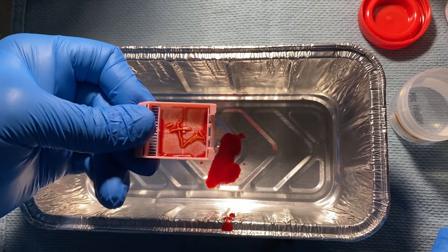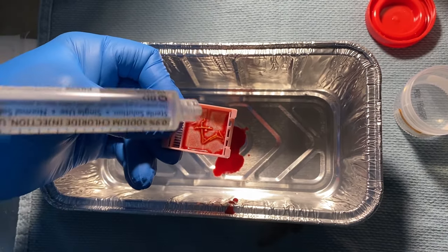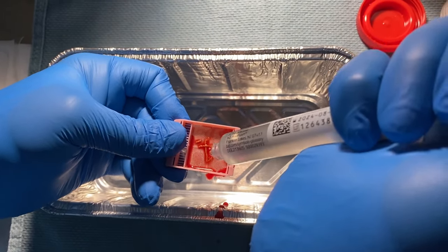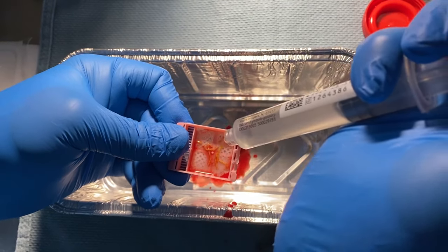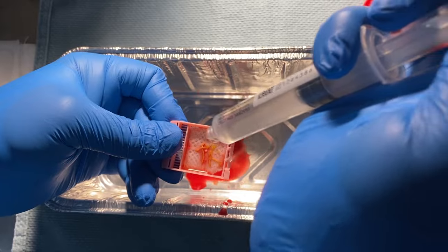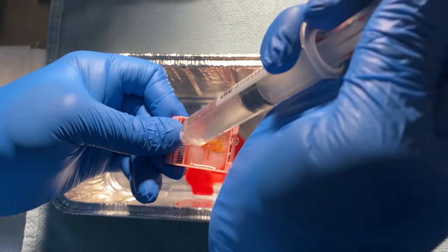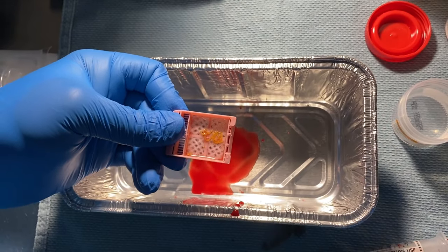The liver biopsy cores are separated from the fluid by use of the tissue sieve. The cores are then rinsed with a sterile saline solution to remove any blood, allowing only pure liver tissue to pass into the surgical pathology specimen cup.